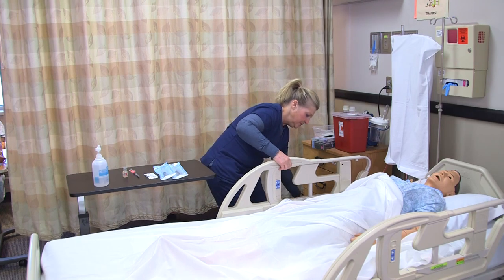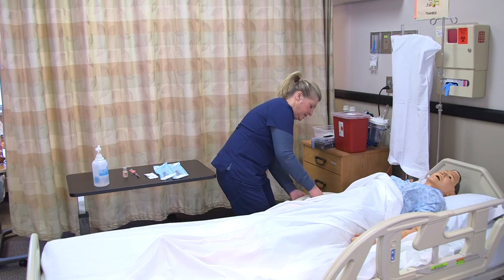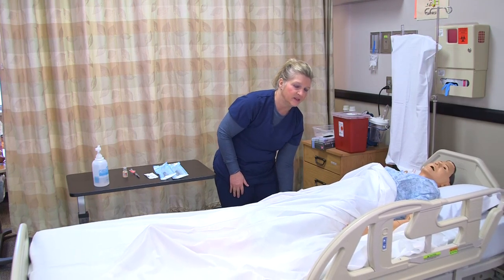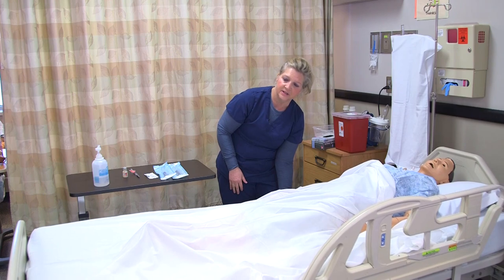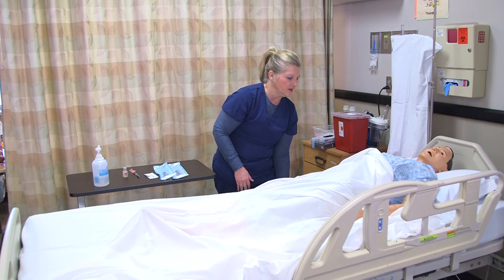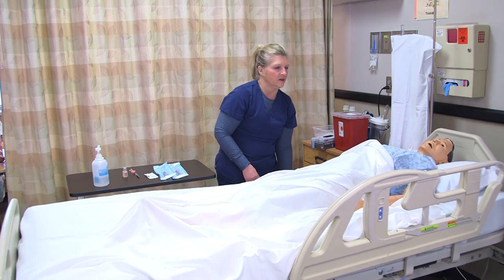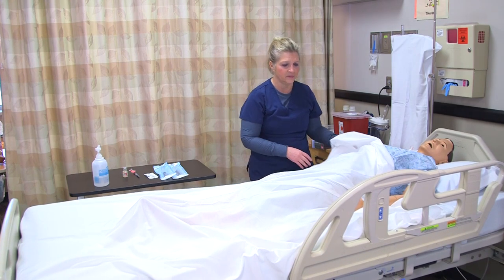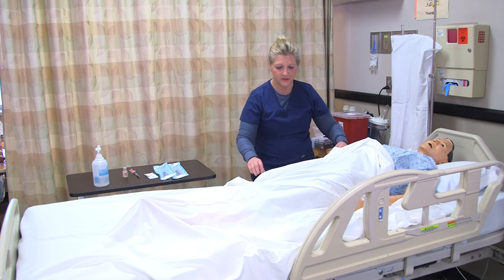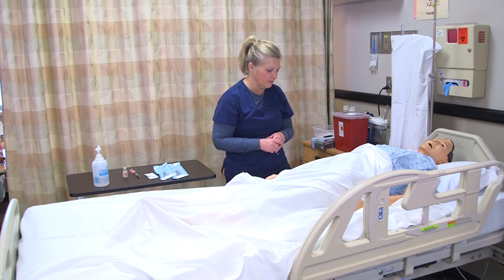I'm going to lower the side rail and raise the head of the bed to a comfortable height, explaining to the patient that I have this medication that the provider has ordered for their condition. I also provided them with any possible side effects and asked if they understood — and they understood correctly what I'm going to be performing.